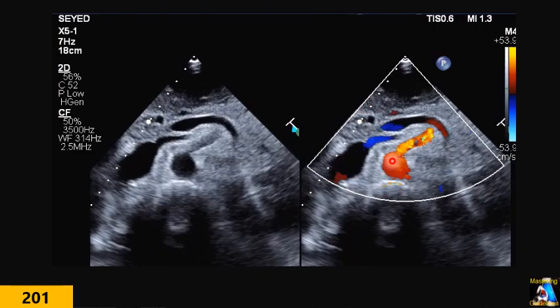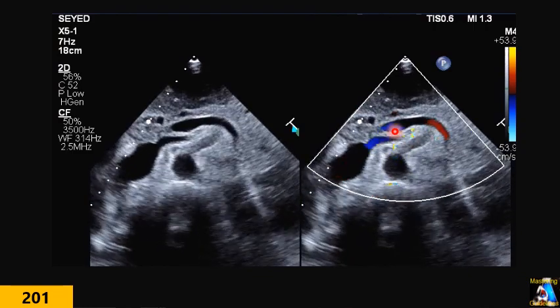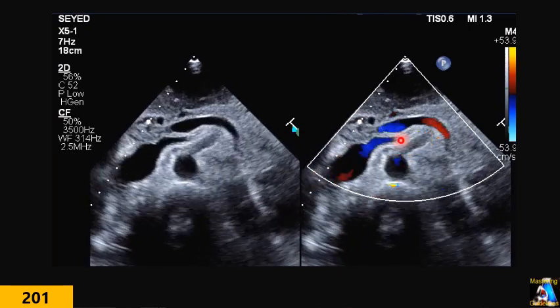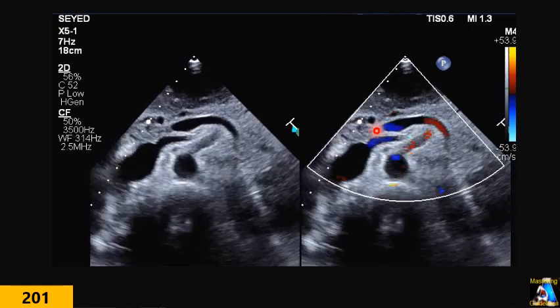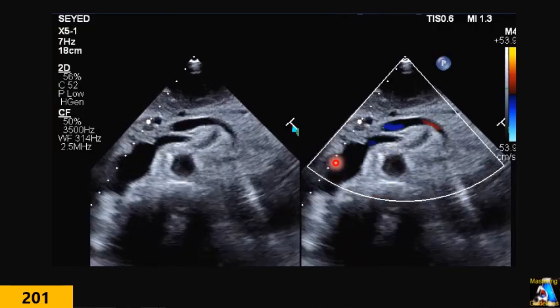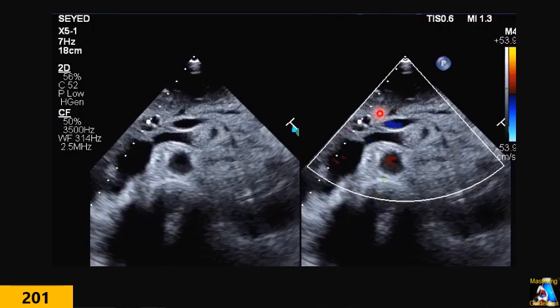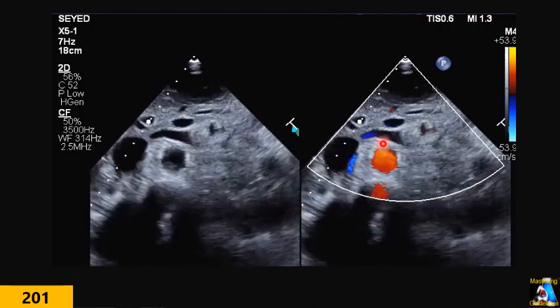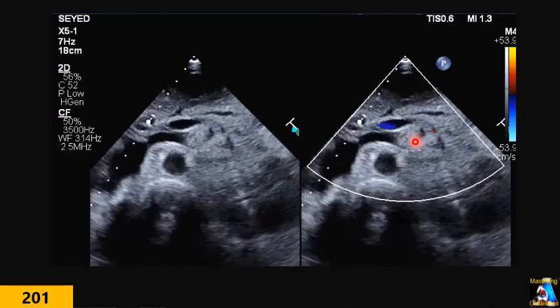But one thing you have to remember here, later we talk about the renal artery. The renal artery blood goes this way too. How you can differentiate if it is artery or vein is very easy: the second connection, the velocity and pulse and all those things, this is collapsing and disappearing and all those things. Later we talk about that.